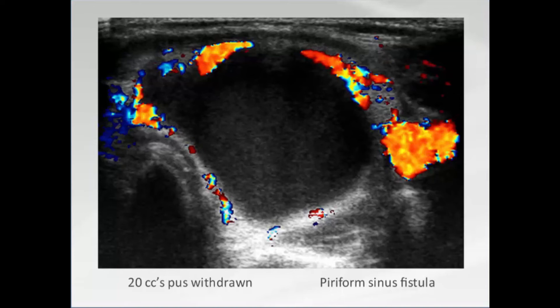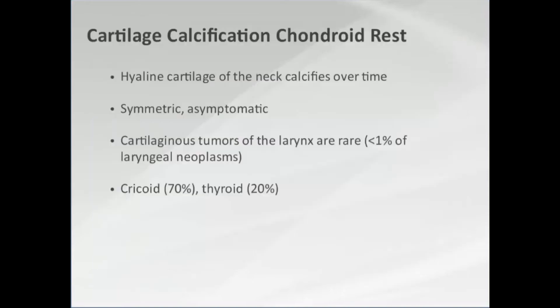The lesion was definitely not solid on color Doppler. When we put a needle in, we got pure pus out of it. She was systemically asymptomatic — no pain, no fever — but 20 cc's of pus were pulled out. This turned out to be a piriform sinus fistula that had probably been brewing for years in her neck and she'd just been living with it.